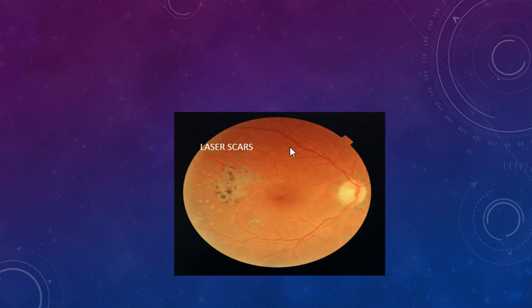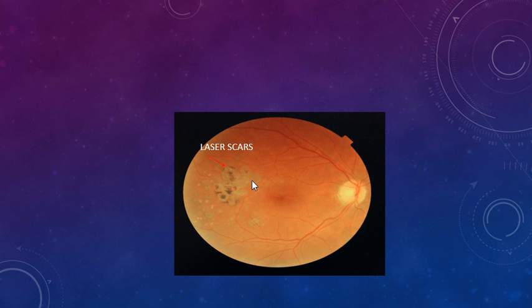This fundus image does not show any significant abnormality at the disc and the blood vessels look fine — no obvious hemorrhages or exudates in the macular area. However, there are some pigmentary changes temporal to the fovea — these are laser scars, appearing to be from quite some years ago, as newer laser machines produce very small spot scars with less scarring. Laser is one of the treatment options for diabetic maculopathy.